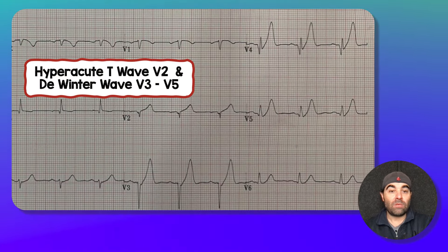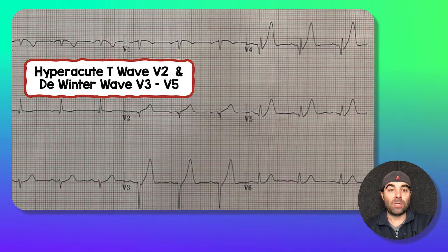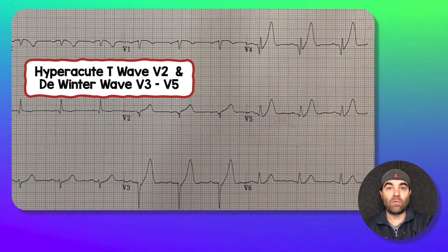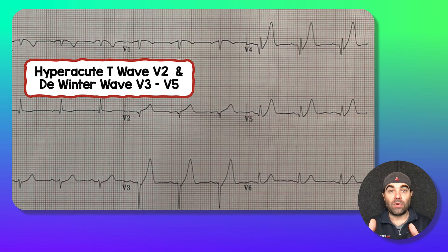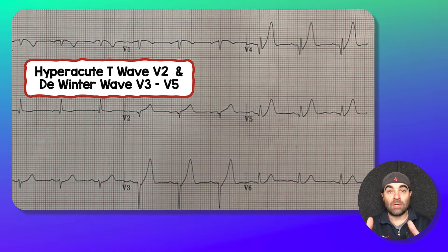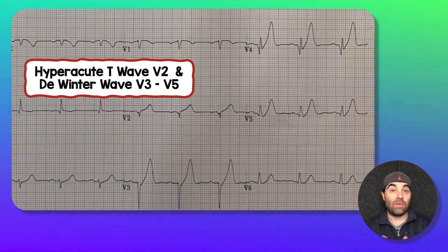Lead V2 — that's a hyperacute T-wave. Your T-wave should never be able to fit over your QRS, and that to me is a simple definition of a hyperacute T-wave. If you can take your T-wave and put it over your QRS and it all fits underneath, that's a hyperacute T-wave in the right clinical setting.